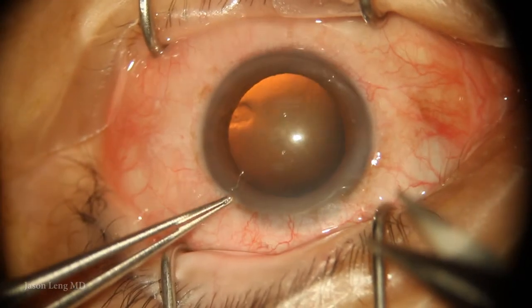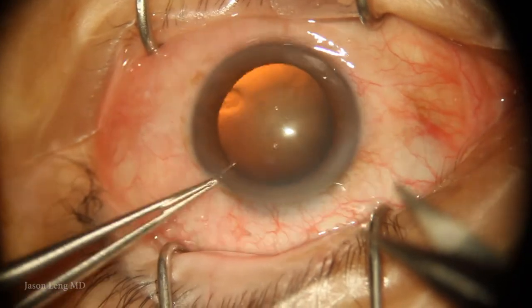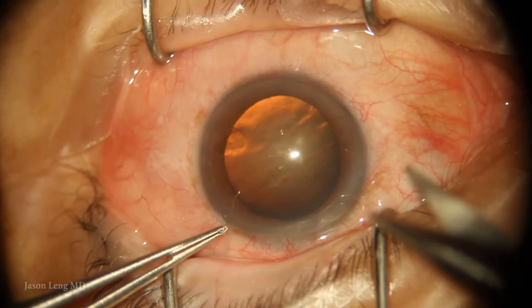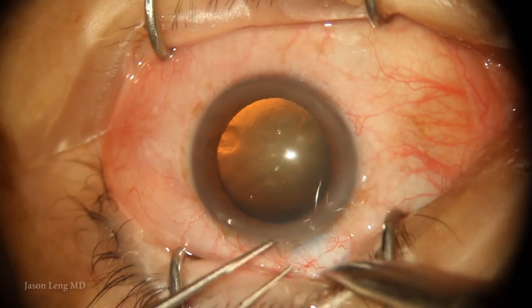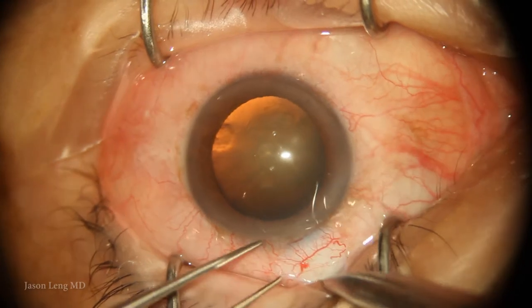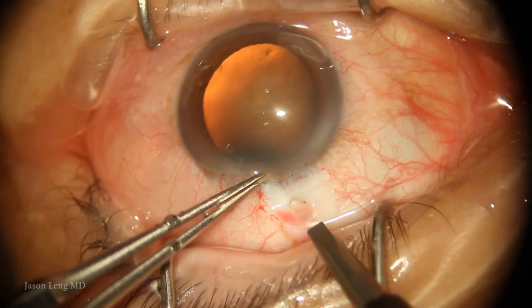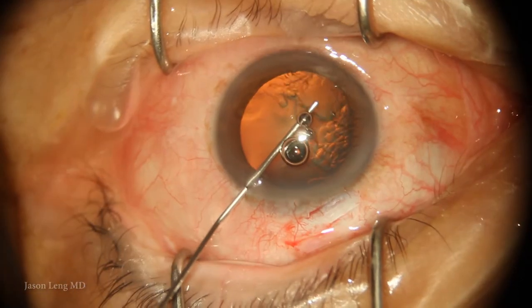This is a case of a 68-year-old man undergoing cataract surgery. He has significant zonular weakness, and shaking the eye before starting reveals quite a bit of phacodinesis. His other eye actually had a cataract subluxed about 30% inferiorly, with a Marfan's-like presentation — however, he had no history or body habitus to support that diagnosis.